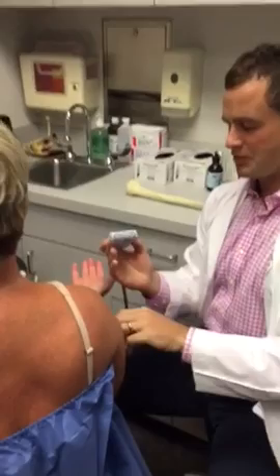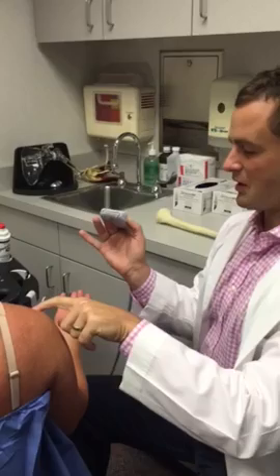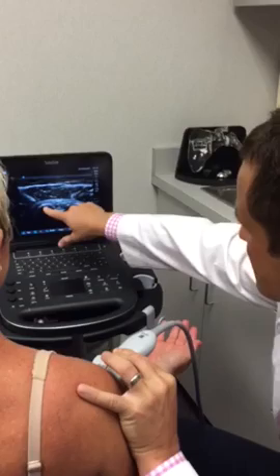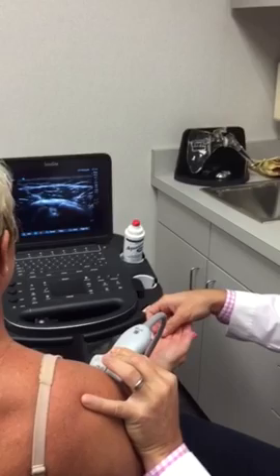The first thing you want to do is go find their biceps tendon. That's the lesser tuberosity, and this is the greater tuberosity. Then we're going to have the patient slowly rotate their arm out — we see the subscapularis — and then rotate back in.